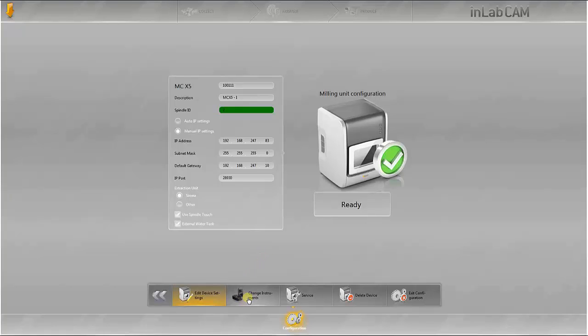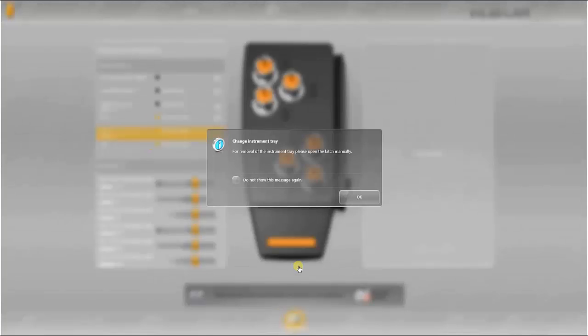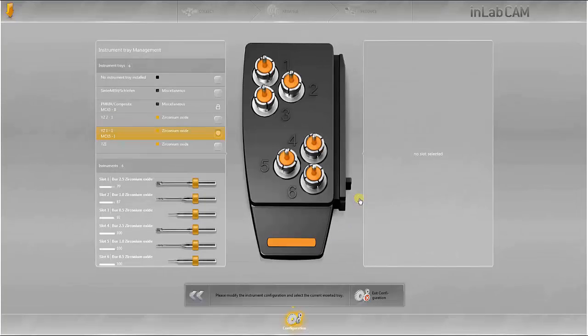You can also change the instruments here. The instrument tray, which is currently in the machine, is firstly shown.